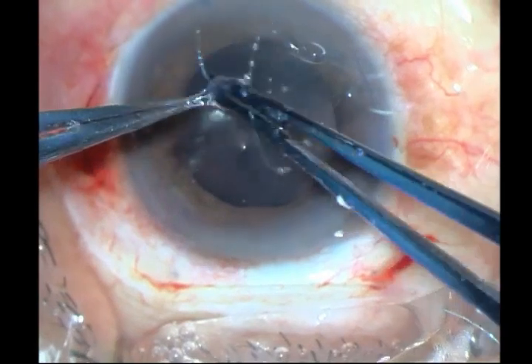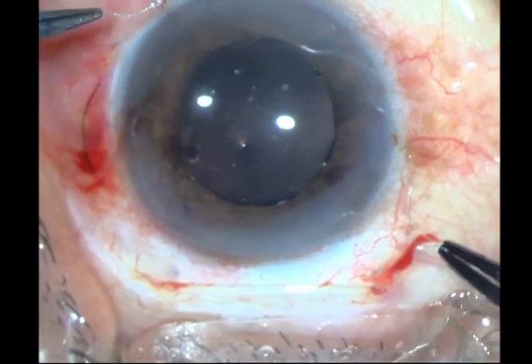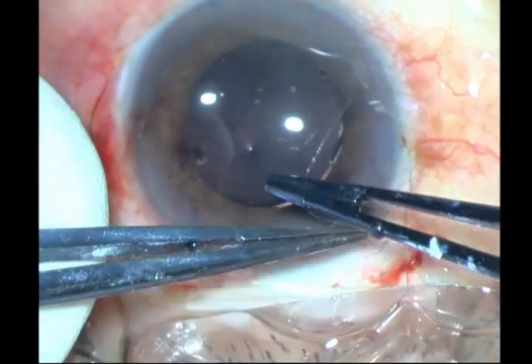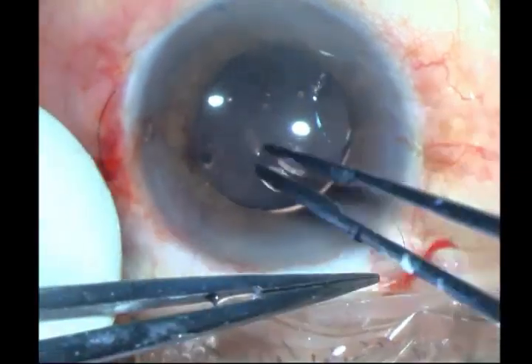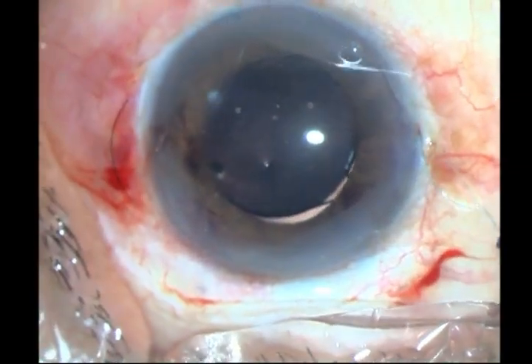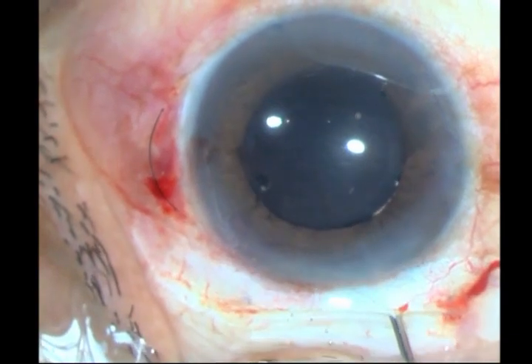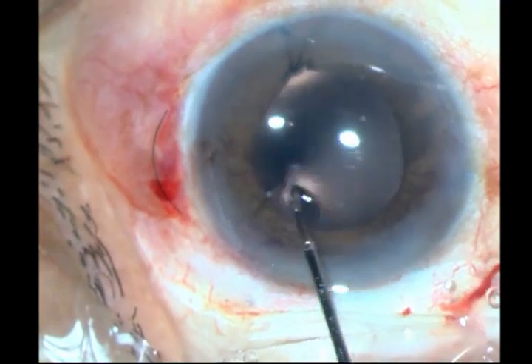I have done one side, now doing the other. Watch how the lens rotates — this is one good thing about scleral fixated lenses using rigid lenses. The knot tends to move on the haptic and will adjust to some extent, so you don't have to be too worried. Make sure you cut off these suture ends and they are not peeping out of the Hoffman tunnel — they should be retracted well within the tunnel.